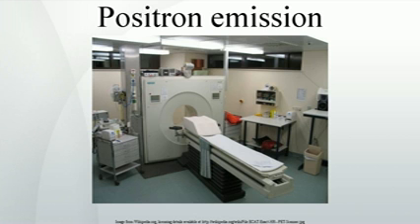Neuroimaging. PET scan of the human brain. Neurology. PET neuroimaging is based on an assumption that areas of high radioactivity are associated with brain activity. What is actually measured indirectly is the flow of blood to different parts of the brain, which is, in general, believed to be correlated, and has been measured using the tracer oxygen-15. However, because of its 2-minute half-life, O15 must be piped directly from a medical cyclotron for such uses, which is difficult.